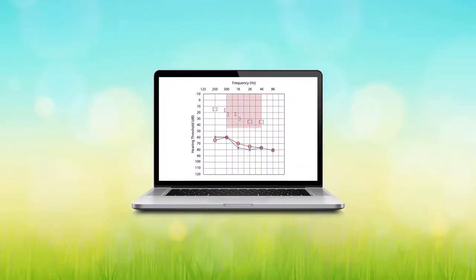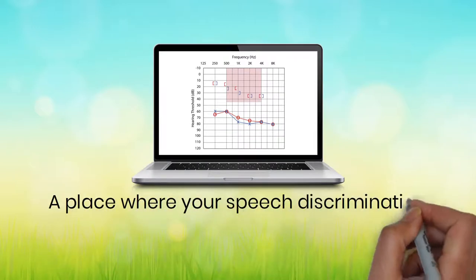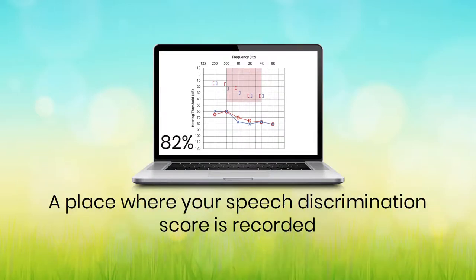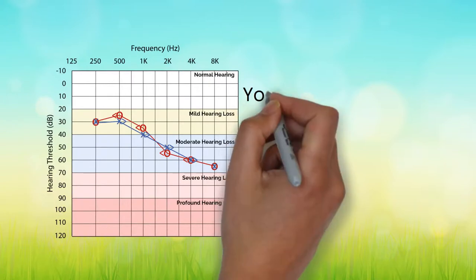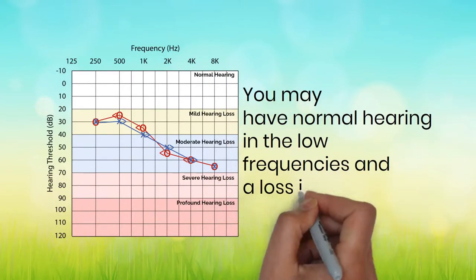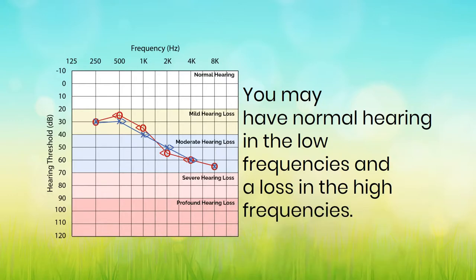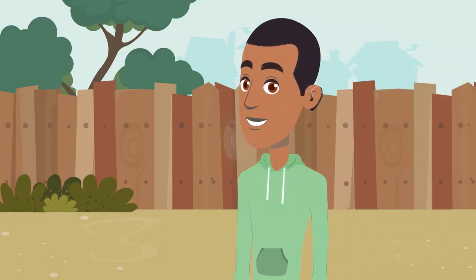You'll notice some other marks for the bone conduction, and you'll have a place where your speech discrimination score is recorded. Your hearing professional will explain what the scores mean, and here is a graph to see how the degrees of loss are labeled. You may have normal hearing in the low frequencies and a loss in the high frequencies. This is all very important when deciding what type of amplification is best for you.